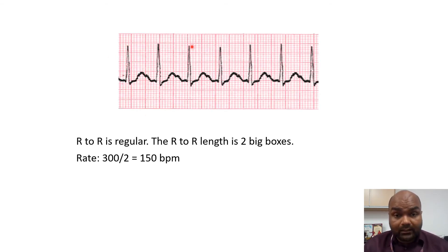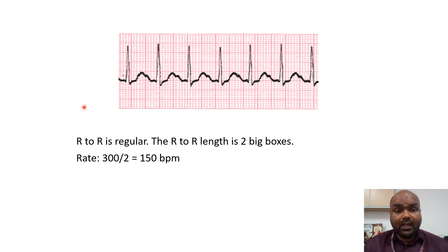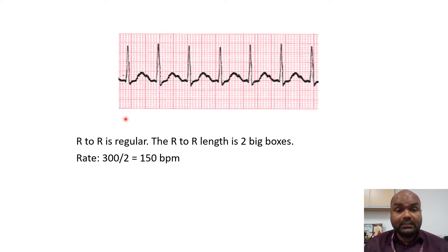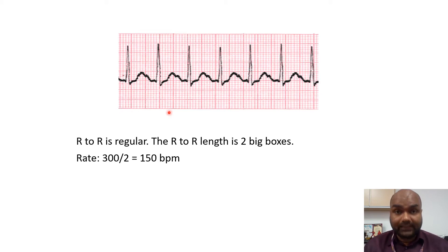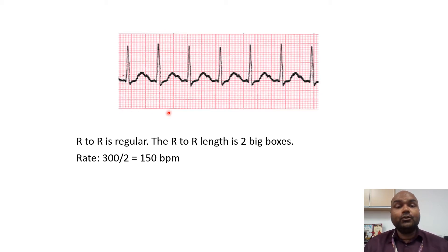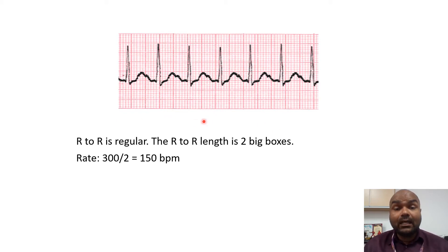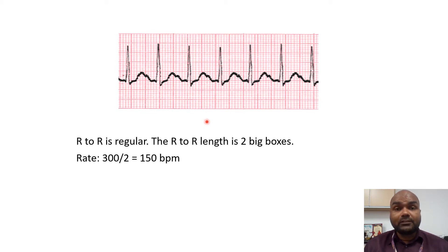Once the R-to-R interval is regular, let's calculate the heart rate. One big box is 0.2 seconds, so five big boxes is one second. In 60 seconds, you have five big boxes times 60, which equals 300 big boxes. So 300 big boxes corresponds with 60 seconds, or one minute.